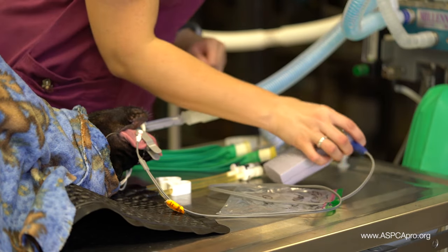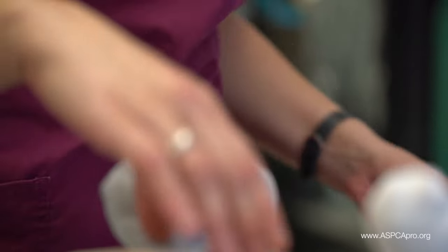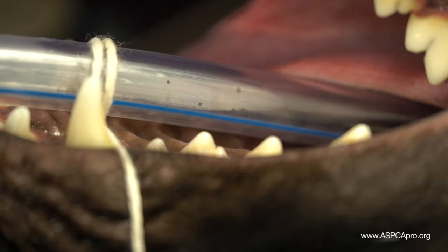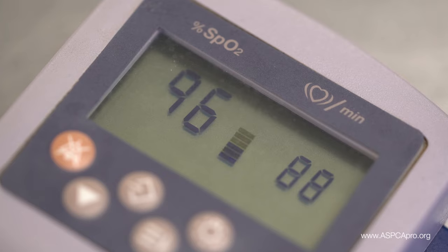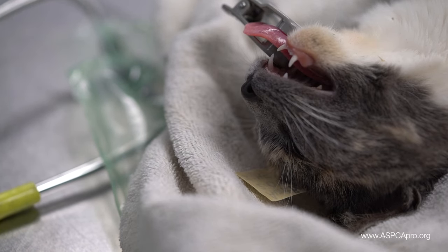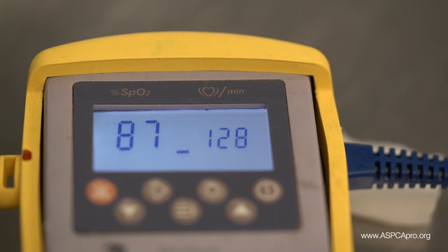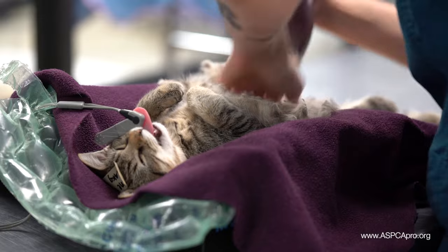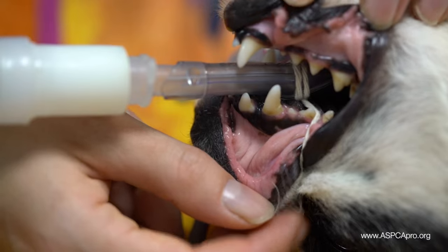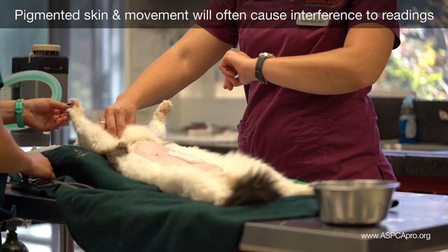Blood oxygen saturation, or SpO2, is measured by a pulse oximeter, which calculates the ratio of oxygenated hemoglobin present in the blood and reports this finding as a percentage. Animals intubated and connected to 100% oxygen, as is the case with gas anesthesia, should have an SpO2 of 95% or higher. Animals not on supplemental oxygen, as with injectable anesthesia alone, will typically have an SpO2 in the lower 90s or upper 80s. A patient that is not breathing frequently, has poor lung function, or is apneic will have lower SpO2 readings and poor mucous membrane color. The pulse oximeter probe is usually placed on the tongue but will often work on the fourth digit of a front paw in cats.